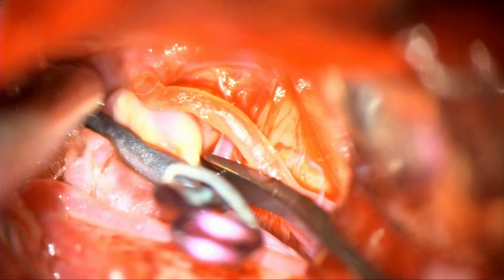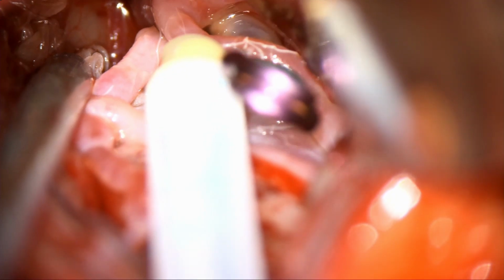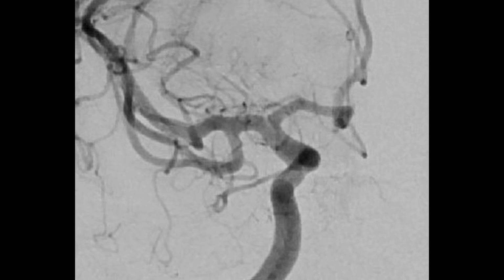First of all, we ensure that no other vessel or tissue is caught in the clip. We then use papaverine to help with spasm. After leaving papaverine on for a short period of time, the vessels are now plump and red and pulsating. Microdoppler is used, and then ICG is used to ensure that all vessels are filling briskly. There's a small amount of kinking, but it's acceptable since the pulsations are good and the aneurysm is completely occluded with no filling. Patient did really well.